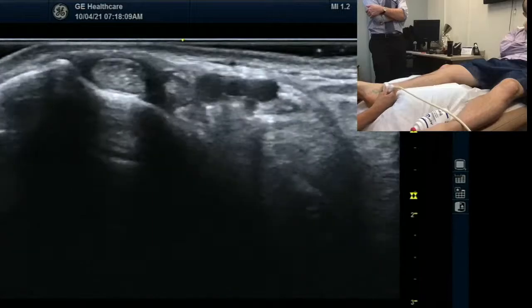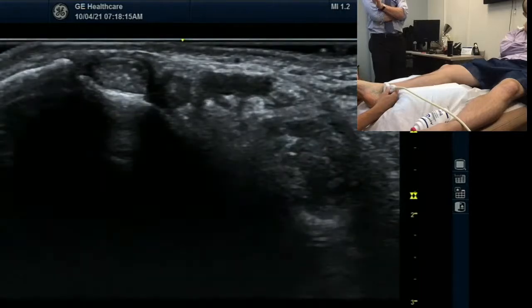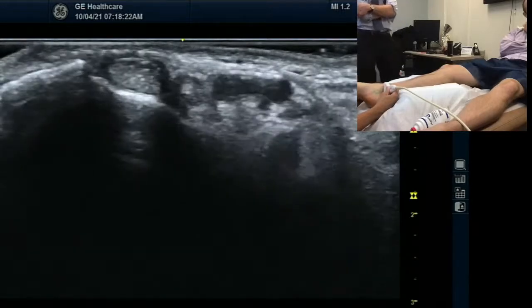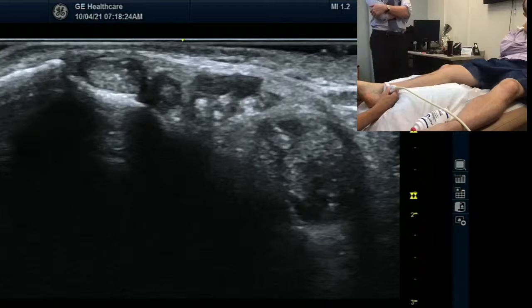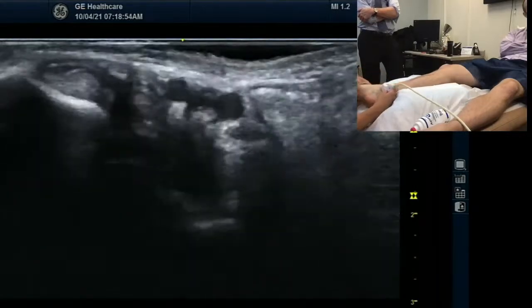Can you make it a little better? So again, flexor hallucis is moving right now. I think a little soft — fluid? So flexor hallucis longus, I think if you're right-hand side of the screen, that's extending. So this is the posterior tip. This is the flexor digitorum longus. This must be flexor hallucis — the big muscle. Then the nerve must be around it. Here it's very hard to see between the nerves. So let's try again. Now you're going to cover a little more, but with the high frequencies, much better resolution.